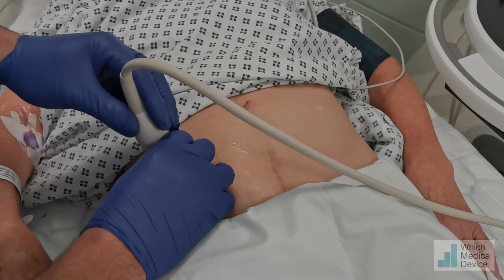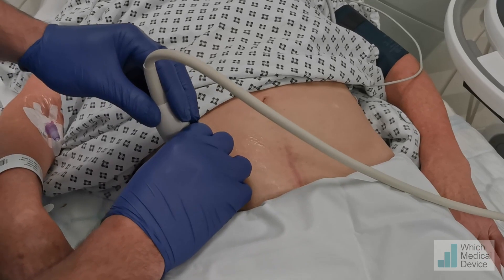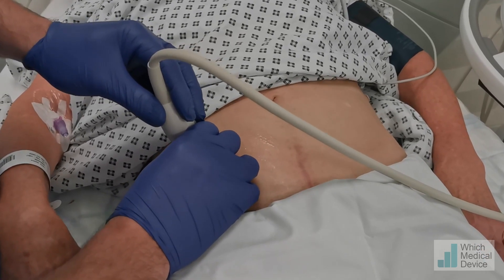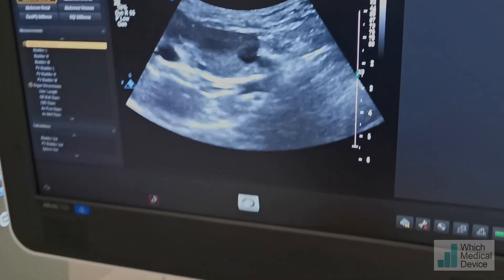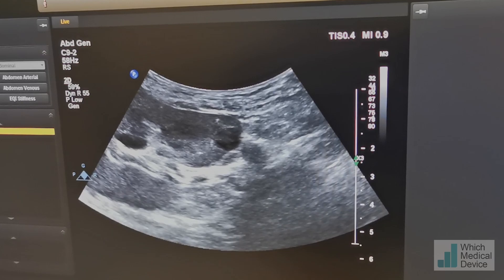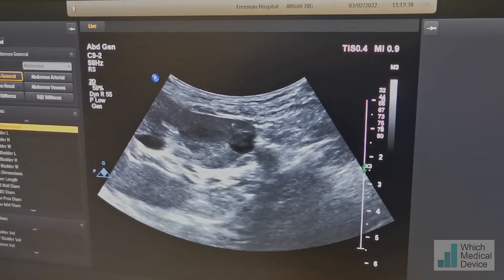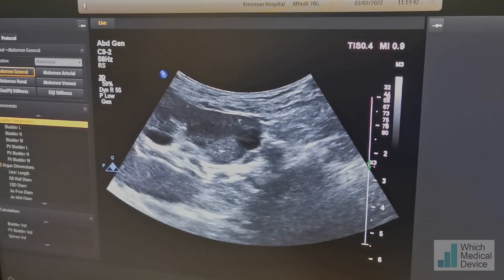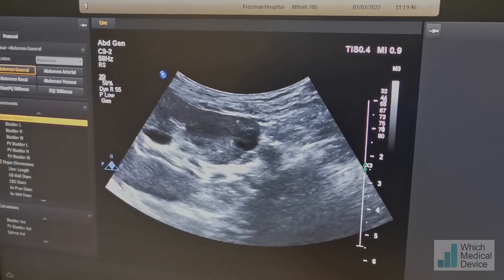This is the patient who we previously ablated intraoperatively — an upper pole transplant renal tumour — and now we're looking at a small lower pole tumour which we're hoping to ablate percutaneously. On the ultrasound, you can see the small renal mass right next to a branch of the renal artery, which is going to try and take away the heat as we try to heat it up with microwave ablation, so that could provide a small problem for us.